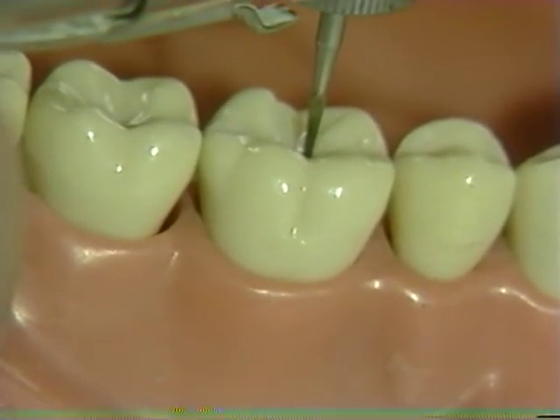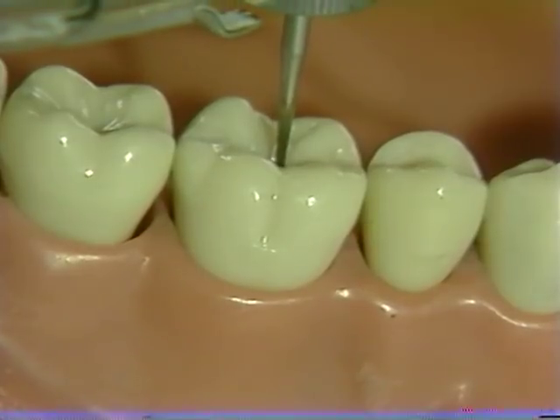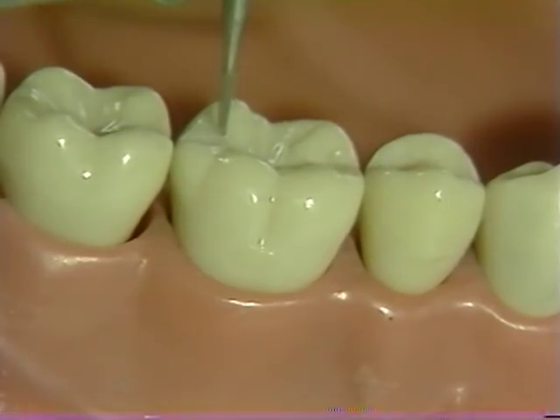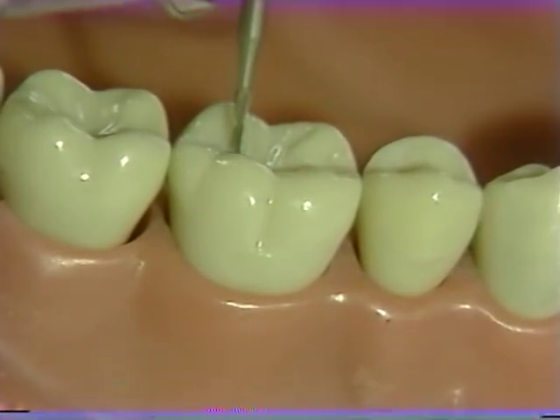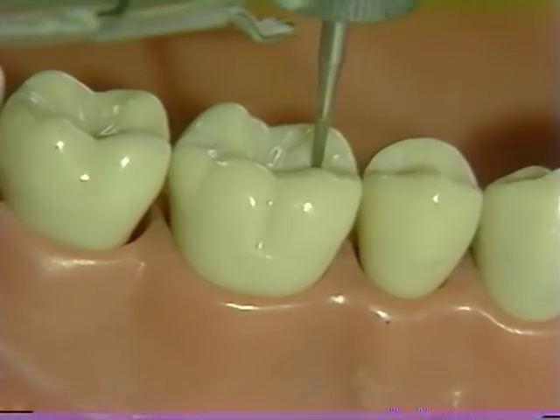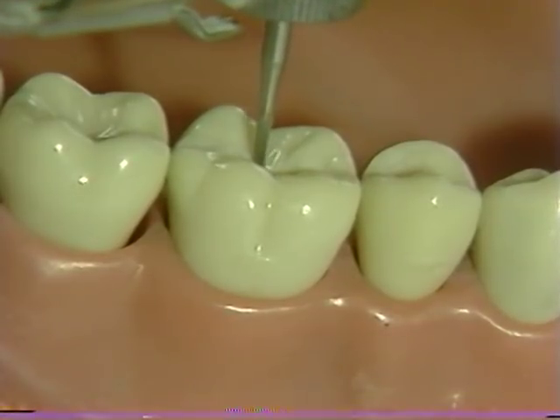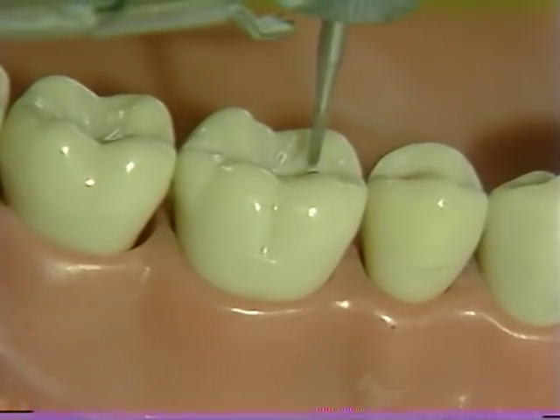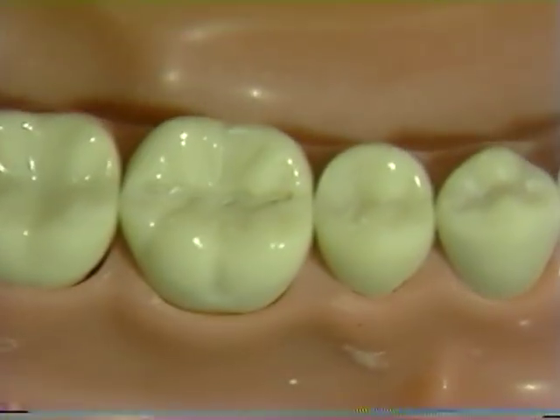Initially, it may be easier to place some depth holes in the occlusal surface. Typically, these are placed in the central pit and are roughly one millimeter deep. Then one is placed in the mesial fossa and the distal fossa. Once placed, these depth holes — after their depth of approximately one millimeter has been verified — can be connected by making a horizontal cut following the normal anatomy of the occlusal surface. This cut can then be extended into the marginal ridge areas and will serve as a guide for the placement of the other grooves.